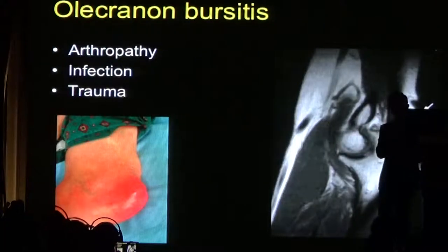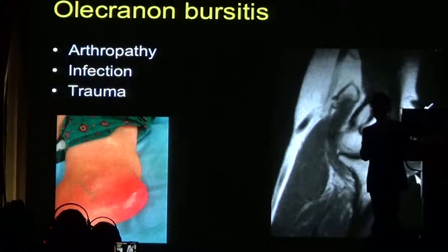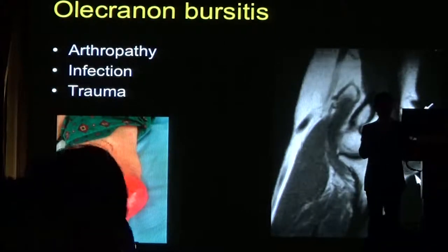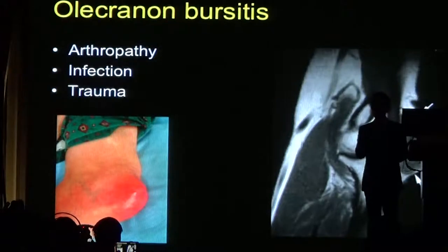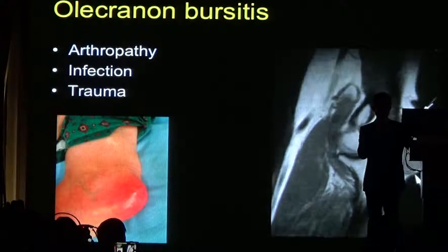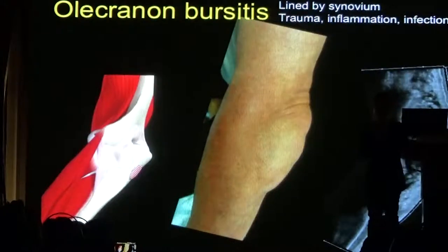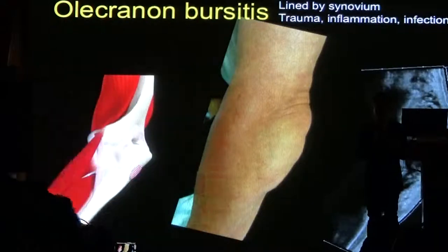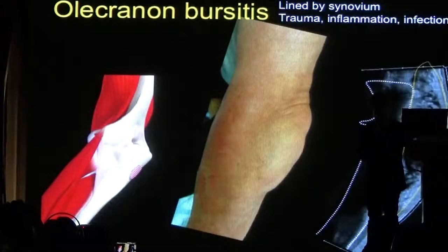Olecranon bursitis is a common condition involving distension of the bursa. Sometimes it can become infected and become very swollen. We are often asked to look at it to make sure there is no involvement of the elbow joint itself, because this is normally just an extra-articular condition. Usually when we see inflammation of the bursa, it is with synovial hypertrophy rather than simple fluid — typically thickened material filling the olecranon bursa.